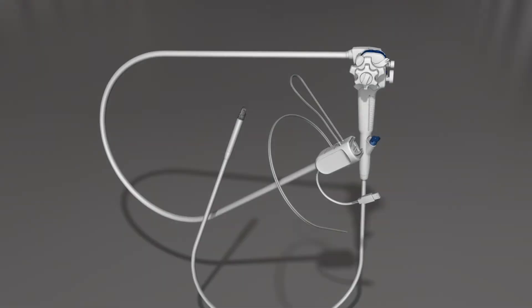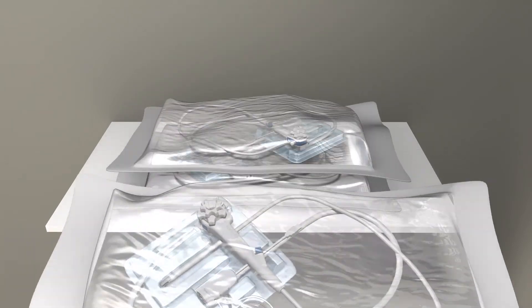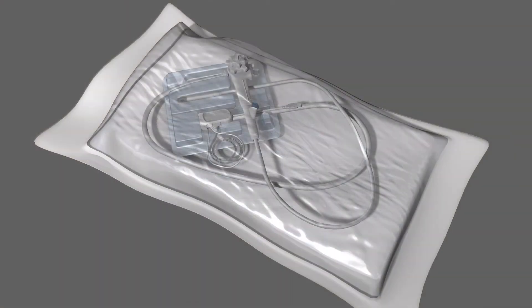The A-Scope Duodino is a single-use device, designed specifically for use with the A-Box Duodino. Each scope is individually packaged and sterile. Check the package before opening for signs of damage. Do not use any endoscopes with damaged or compromised packaging. The pouch should be sealed and intact.